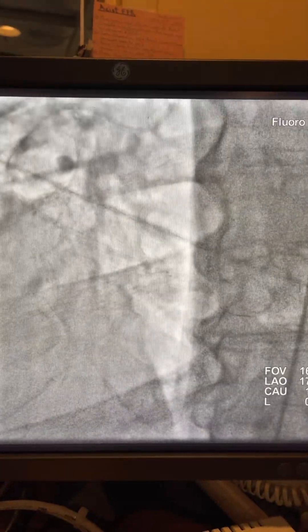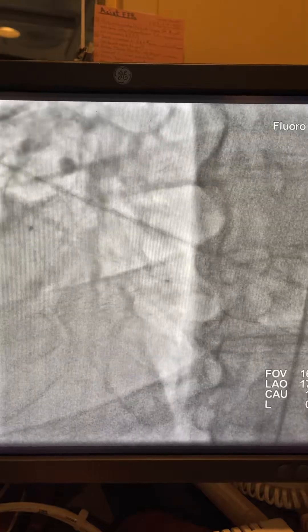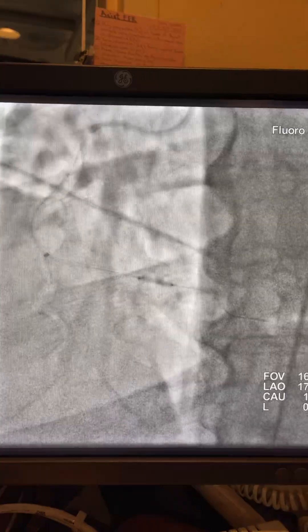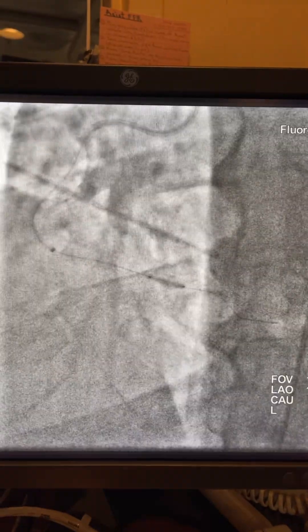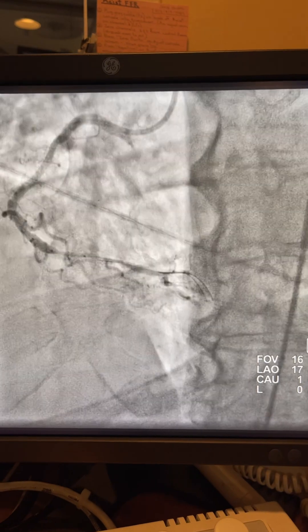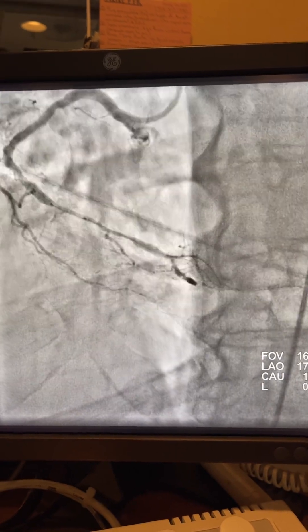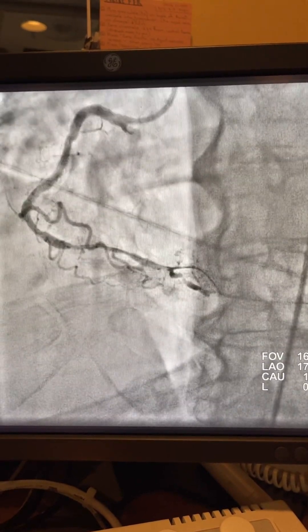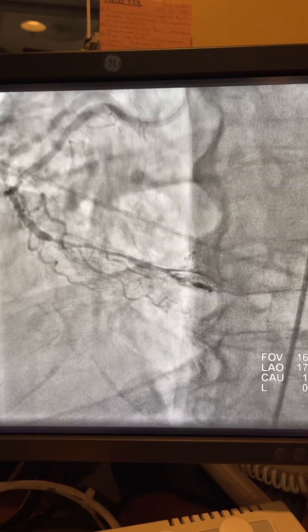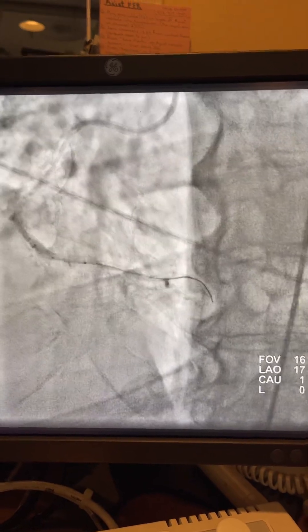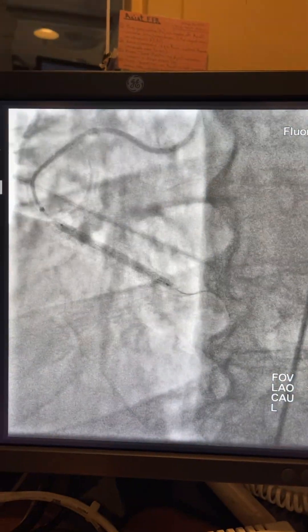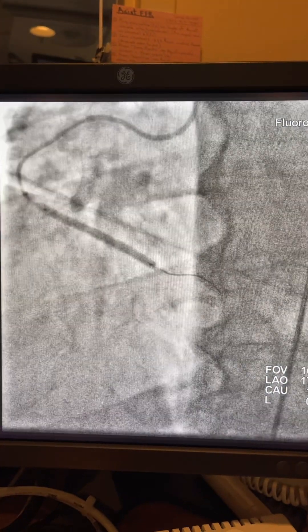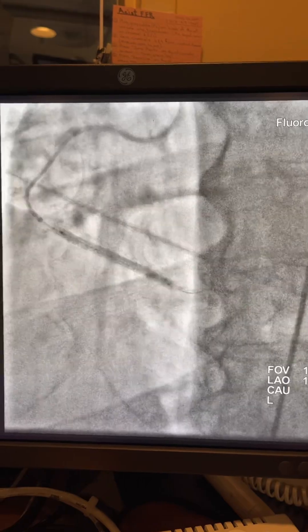Use the same balloon, inflate it, then upgrade to a 2.0 balloon, then do an angiogram to make sure we are in the true lumen. I have a guideliner here, followed by stent placement in the RCA, then stenting in the PDA.